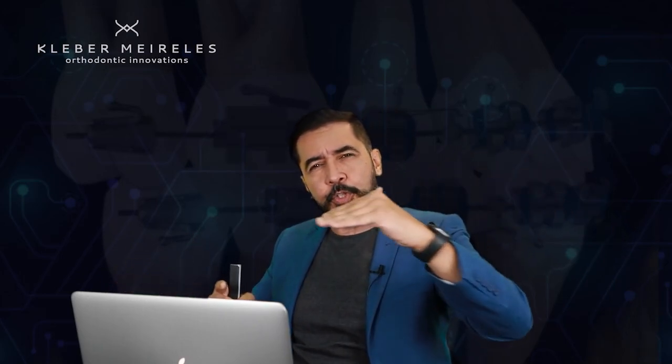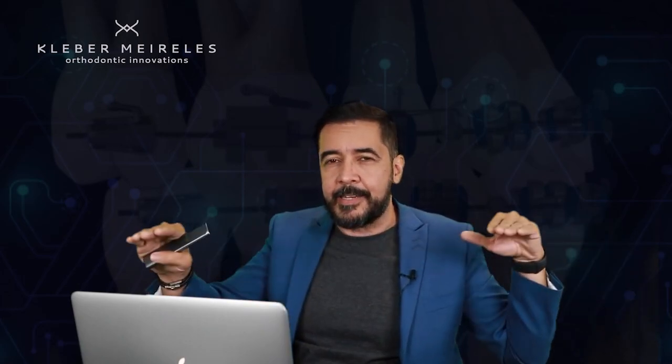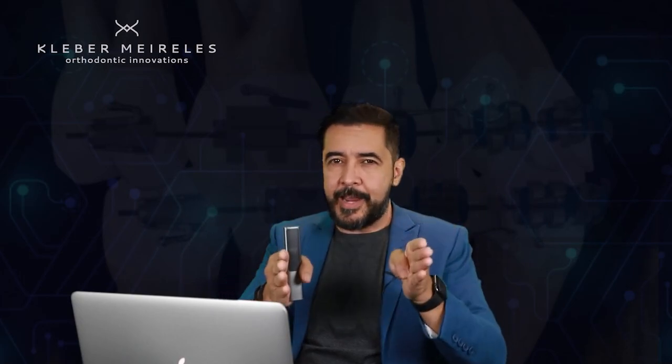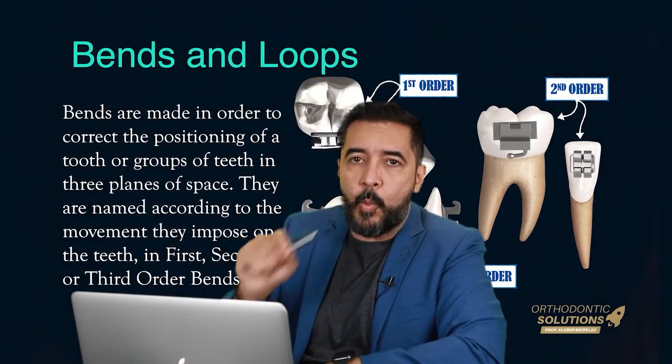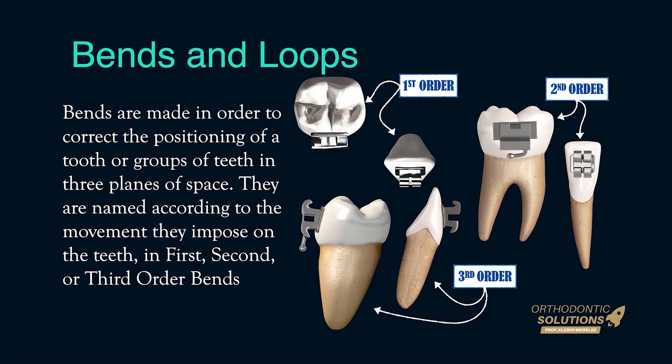So this is important because you want to do a smooth treatment, from the beginning to the end, like a line, doing everything correctly in order to do a very, very short treatment. So you are shortening your treatment line because you don't commit mistakes in the beginning of the treatment. So this is what we are going to focus on, okay? Bends and loops. Let's begin with these two beautiful words for me.